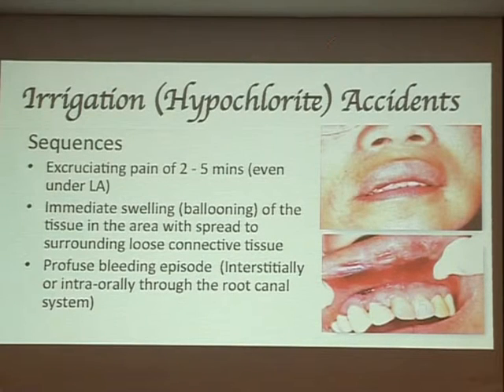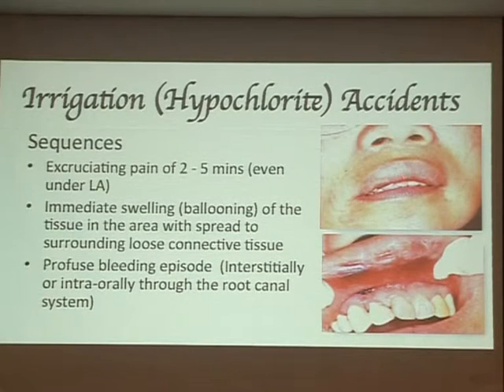This is my case. I'm working on one of the incisors for retreatment. When I irrigate, I admit that I'm very careful, but the patient suddenly felt very painful. You can see blood from the canal. I knew I had a hypochlorite accident.